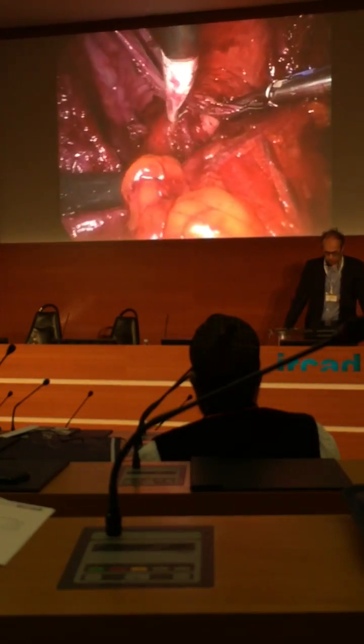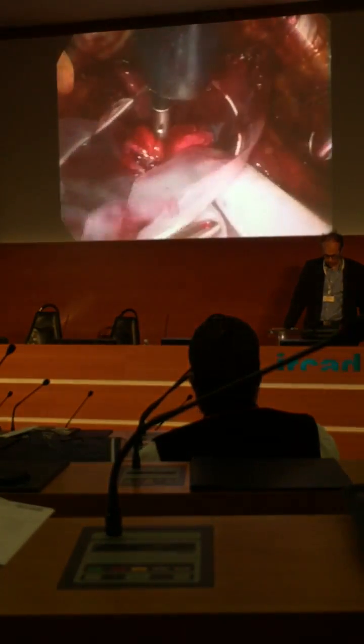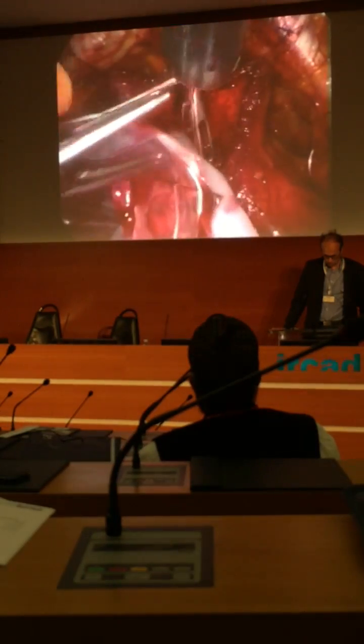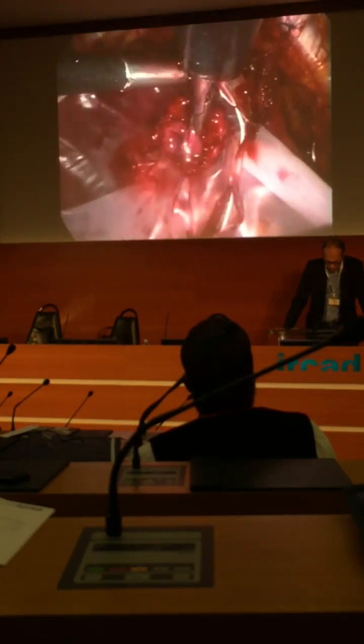So it seems the diverticula is completely removed, and you can place it in an endobag. We do the same with the second diverticula.